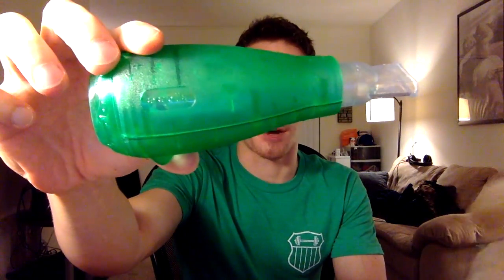In college they introduced the Acapella, which is pretty popular among handheld devices. The idea is you take a big deep breath, hold it, and then blow out steadily into the device. It sends vibration back down into your lungs, shaking all the mucus up so it's easier to cough up.